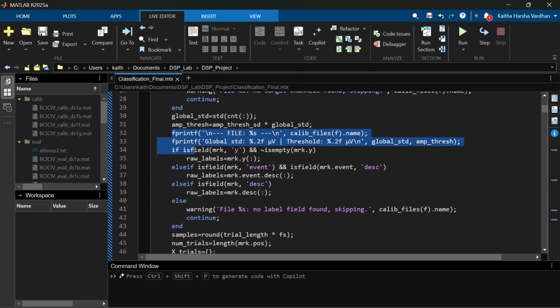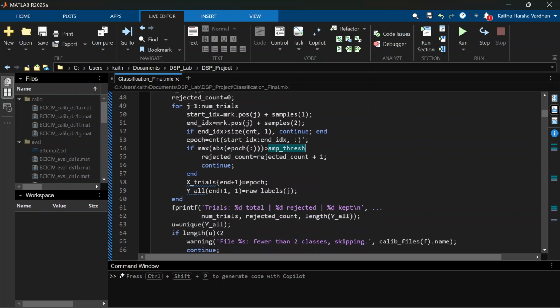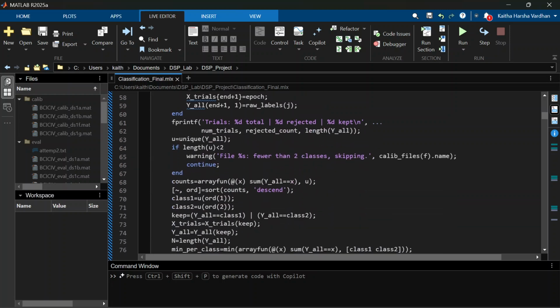In this part, we look for the labels. We find the labels where the data is starting and where it is ending. On the website, there is a clear description of how the dataset files are given. Basically they have a start position and an end position marker, so we need to extract those labels. After that, this is the artifact removal. If the epoch or time window is greater than the amplitude threshold, we just remove it and increase the rejected count. In that way, we do the artifact removal.